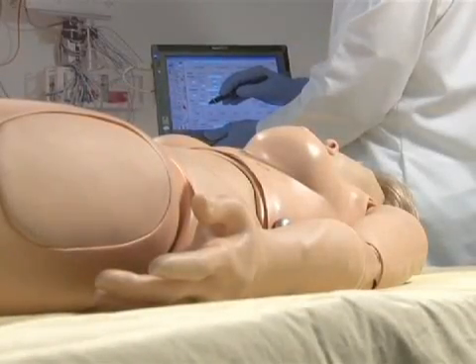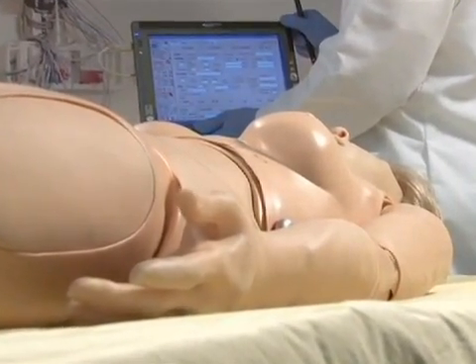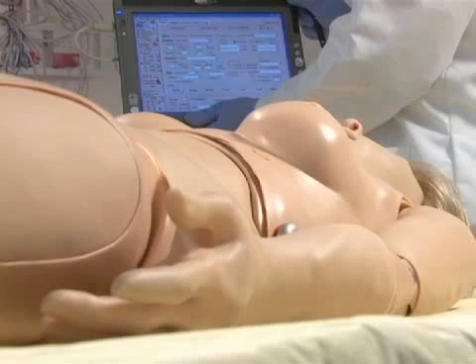Suzy is outfitted with a seizure mechanism that can be used in conjunction with scenarios. The severity of the seizures can be programmed with a touch of the stylus, and there are two different intensities to choose from. Providers can perform finger stick and draw samples of simulated blood, treat decubitus ulcers and an ulcerated foot. Suzy also features a pulse oximetry sensor within the forefinger of each hand, allowing providers to attach commercially available pulse oximetry devices and determine Suzy's oxygen saturation.